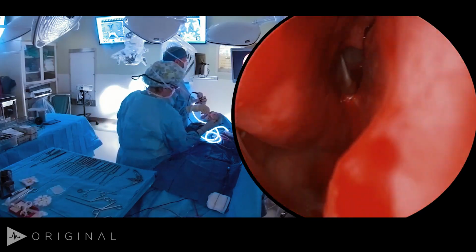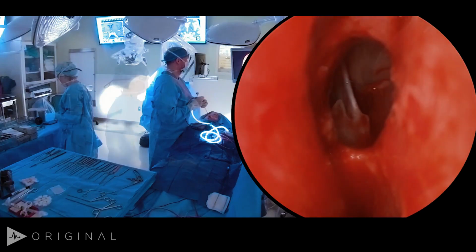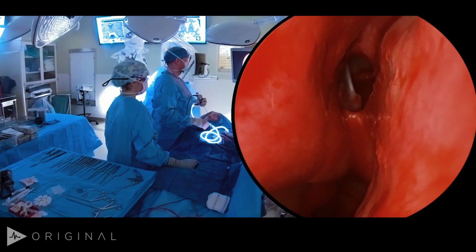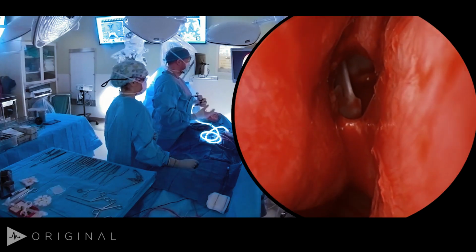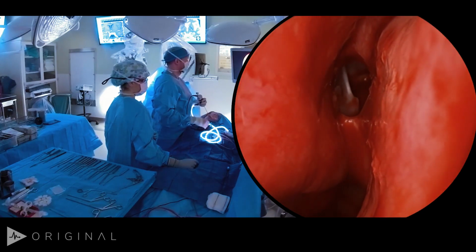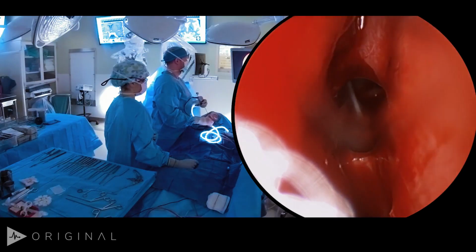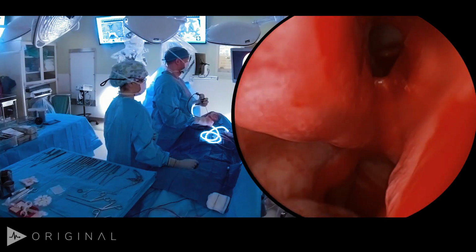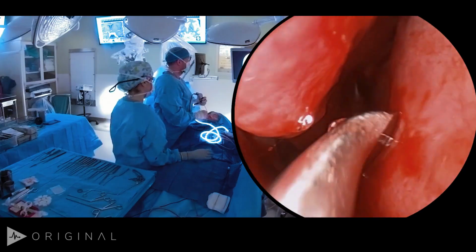Okay. So now things have settled down a little bit for us. We have a nice wide opening there into the sphenoid os. So now we want to raise the nasal septal flap. Depending on the type of surgery and the type of skull base coverage that you might need, if you're concerned about a CSF leak, you might raise a longer nasal septal flap along the septum. For this case specifically, we're just going to raise a very short one and bring it straight down. We're going to try to basically start at the top of the sphenoid os here and then bring it down towards the floor.